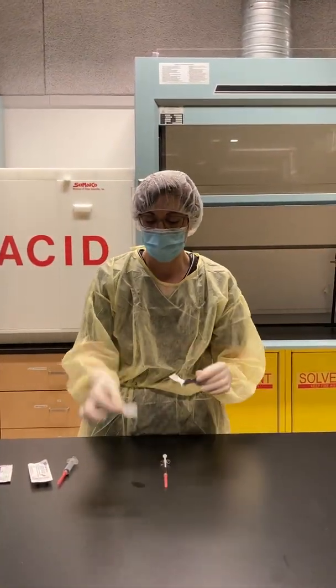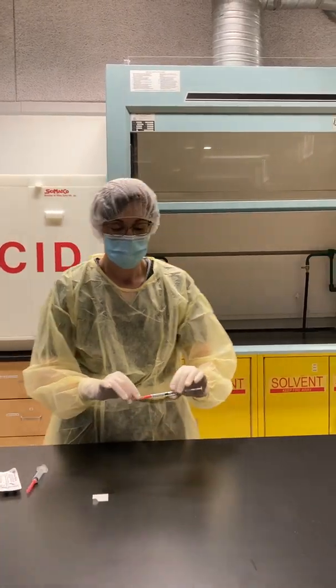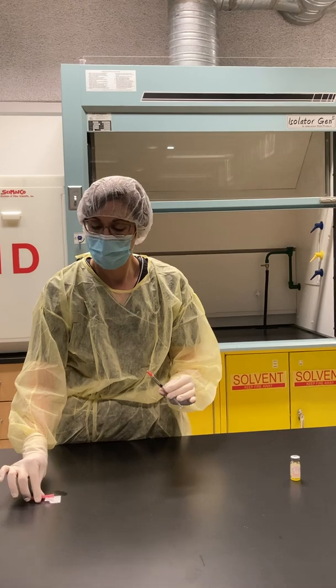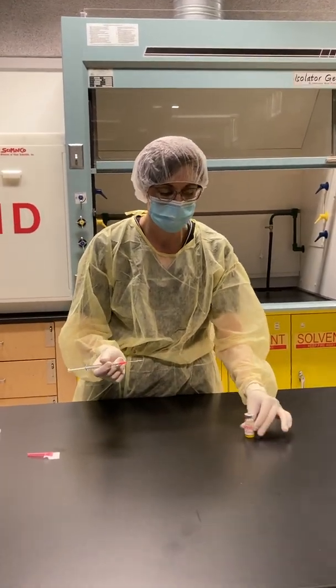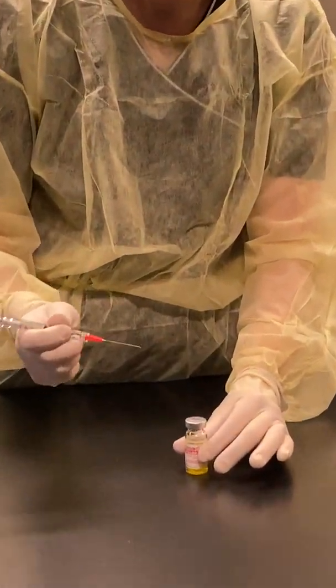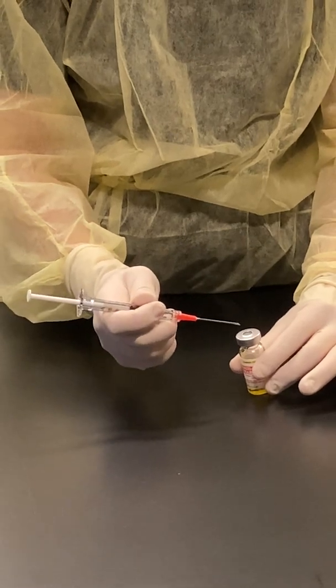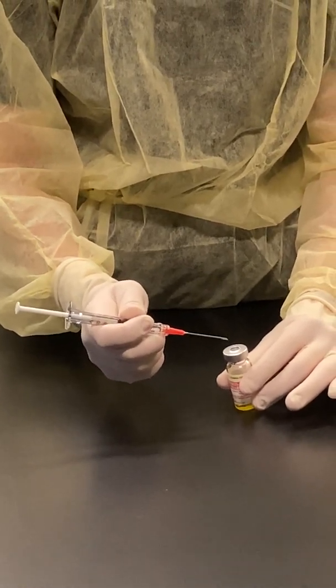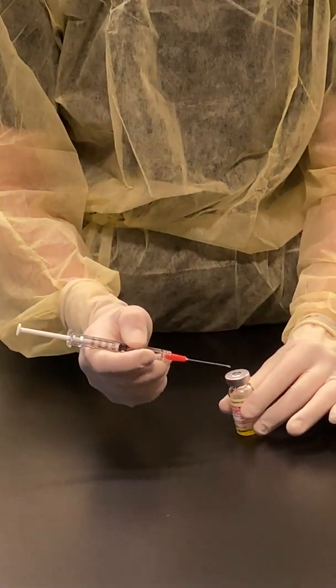I'm going to take another alcohol swab and place it on my work surface for my needle cap. I'm going to enter my vial, but I have to make sure that when I puncture it, it's not in the same spot I punctured when reconstituting the vial with normal saline — otherwise you'll get coring.